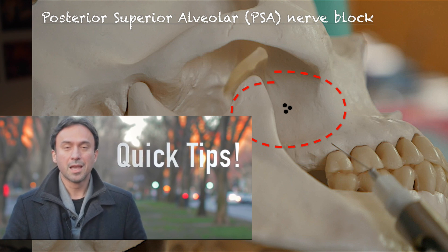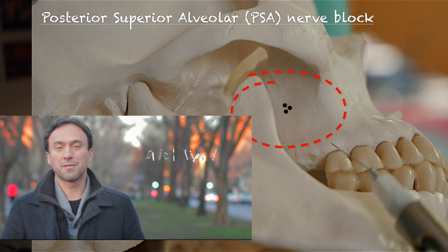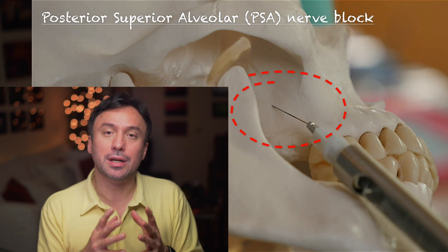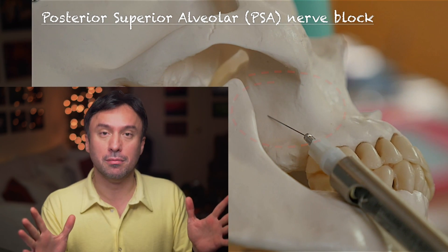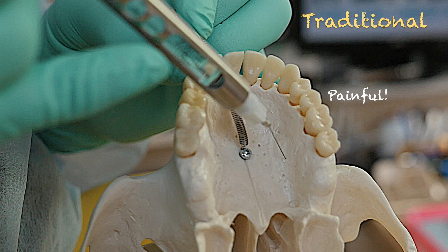Hello Rewell Clinicians, this is Ali in SA, and today's video is a follow-up to a quick tutorial I did recently, where I described the posterior superior alveolar nerve block as the best way to administer local anesthesia for root canal therapy in all maxillary molars. The goal of this technique is achieving profound anesthesia for root canal therapy without the need to administer the additional and very painful palatal infiltration. After that tutorial many of you asked me to describe my personal PSA technique in more detail, and this is basically the purpose of this video.